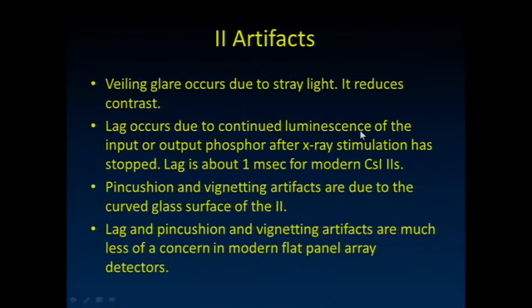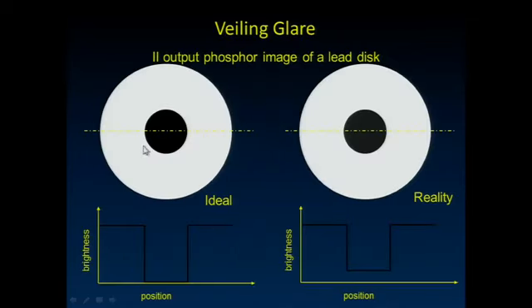So you could really end up with a system that amplified the input image brightness 50 times, which was very, very helpful. Unfortunately, those old IIs had a number of artifacts. Even our current ones suffer from lag, right? They're not as quick as movie cameras, so as things move, we see a little bit of persistence and the motion lags behind a little. They have something called a veiling glare. Ideally, when something struck the input phosphor, it should look like this, but by the time it hit the output phosphor, there was a little reduction in contrast because some of those electrons may have strayed off path.